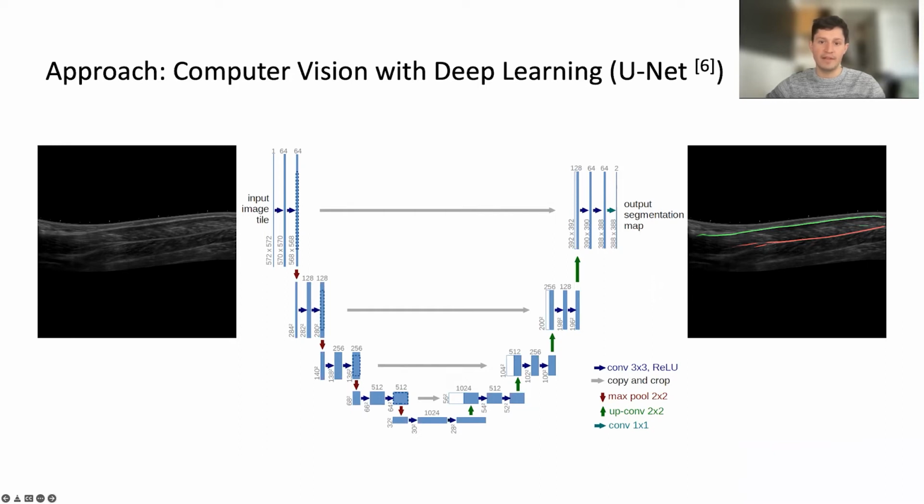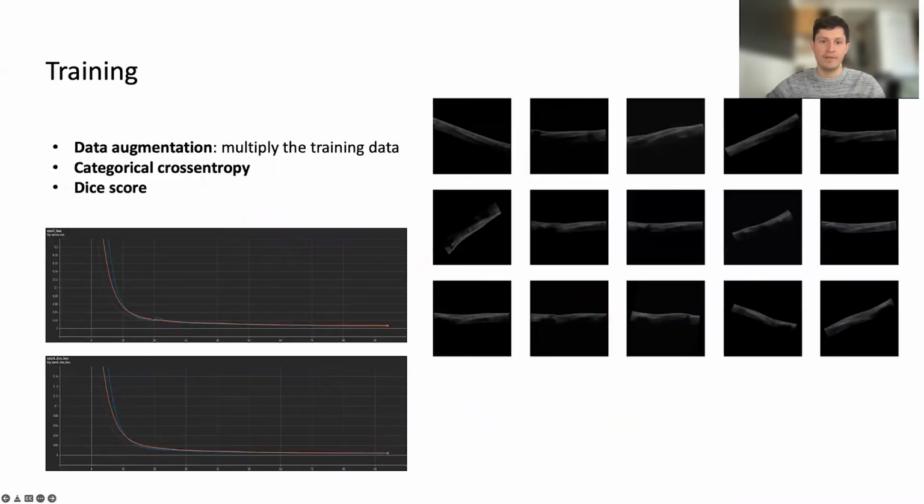The two images on the sides are an example of this classification method. The input image on the left side is a simple preprocessed input of an ultrasound image, and the one on the right side shows the result of the prediction. We aim to find and differentiate between the upper aponeuroses visible as the green line and the lower aponeuroses shown as the red line. Since the lines are usually distinct, the image is more or less similar, and the model seemed to fit the task well, as it was originally designed for biomedical applications.